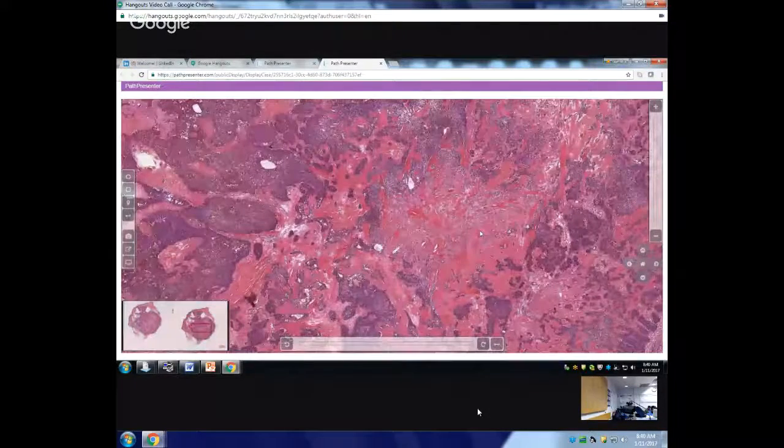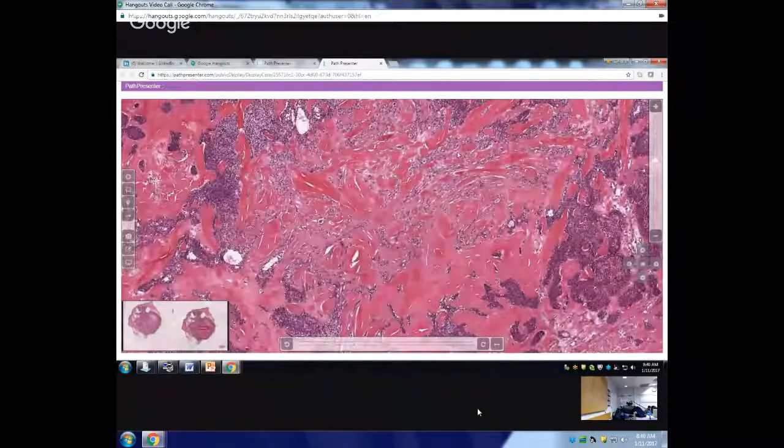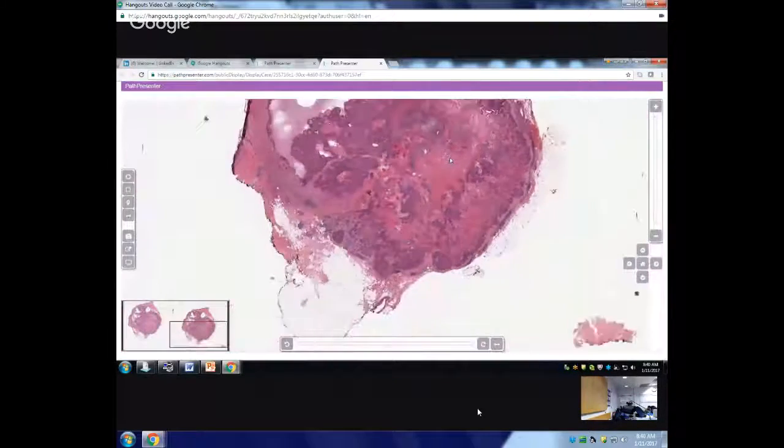And these can be on your boards because these are very straightforward diagnoses, so you can always get slides of these on the board. The only way to learn about these cases is to look at as many cases as you can. Now we have all these repositories available online, and these are free cases for you to view.